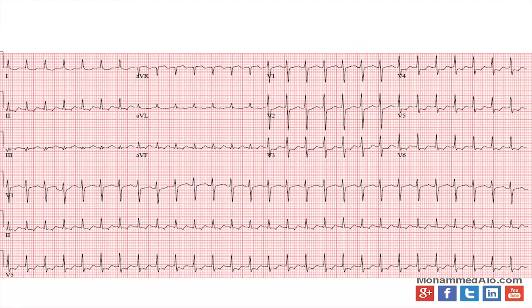The next one here is very, very tachycardic. You see almost no P waves, or they're kind of coming after the QRSs. This is your basic AVNRT. Junctional tachycardia never goes this fast. AFib would be irregular. Now, AFib sometimes when it's really, really fast looks very regular. But if you slow it down, you can tell what it is. This guy needs some adenosine or some vagal maneuvers and will convert. If you give them adenosine and they slow down and they look like they're in AFib, then it's AFib. And obviously they need calcium channel blockers like diltiazem or esmolol or some kind of a drip to slow them down. But diltiazem seems to be the best.